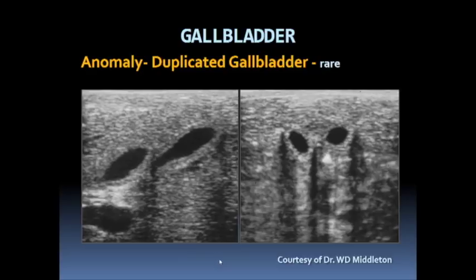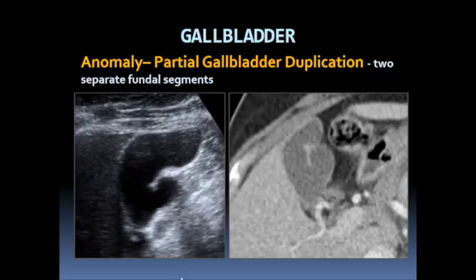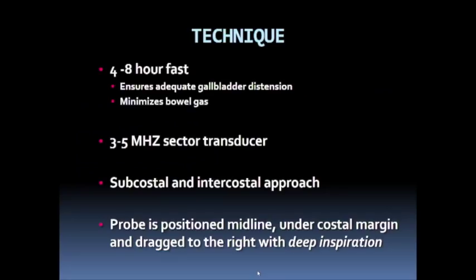Other anomalies include duplication of the gallbladder, which is an extremely rare anomaly. In this patient we see complete duplication of the gallbladder with two structures immediately adjacent to each other on longitudinal and transverse views. Another patient shows partial duplication with two separate fundal segments, illustrated on both ultrasound and correlated CT imaging.